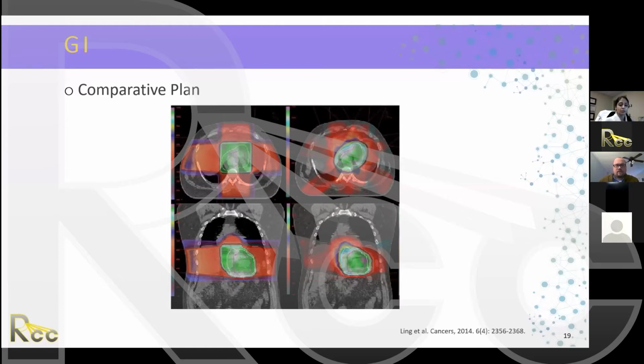But if you do have the technology available, you can definitely use 4D CT and get a better idea of organ motion and everything. But just given the standard protocols right now, I'm not too worried about missing the target, especially since I do obtain cone beam CT before I treat every patient. Thank you. There's two more questions. I'm going to lump them together. Can you comment on the spillage of doses in esophageal cancer for IMRT and the selection of beam energy, such as 10 or 15 MV?